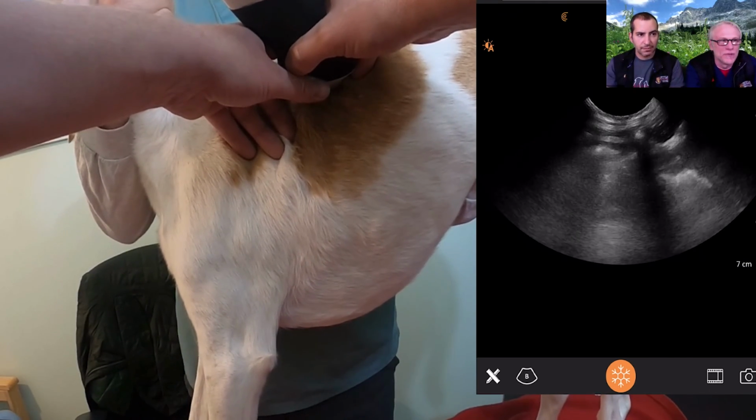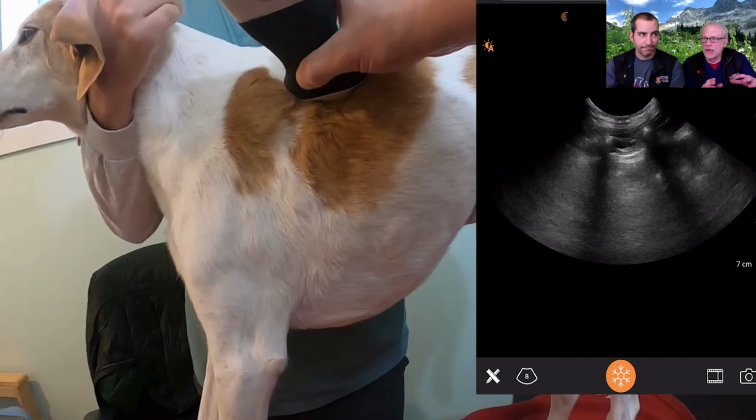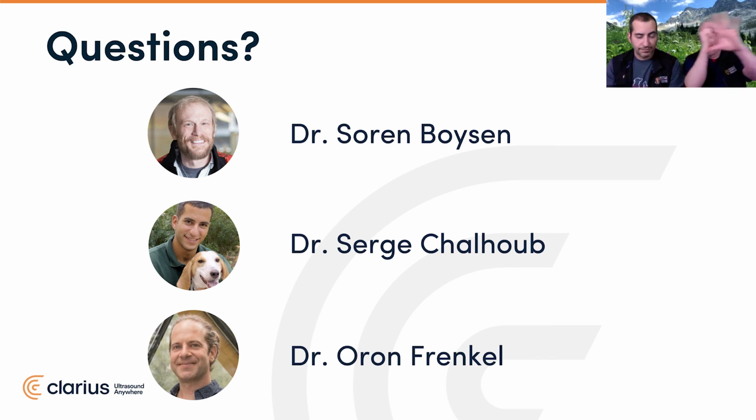That is how we rapidly rule out. It's similar to when we do a chest tube in our small animals. Most people will know what we're talking about. You pull the skin to the site you need to start with, separate the fur, and then with my left hand, I can move that pretty much anywhere over that hemithorax.